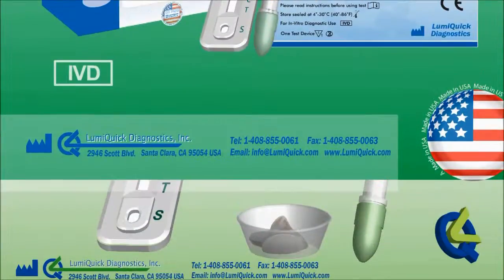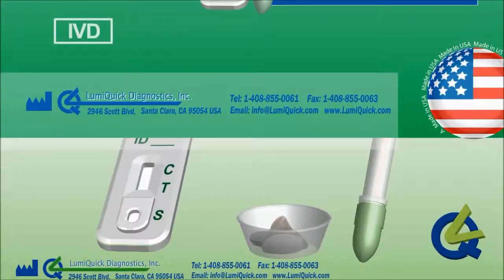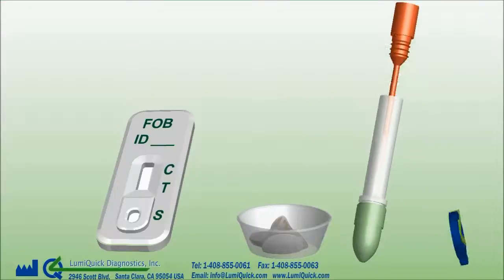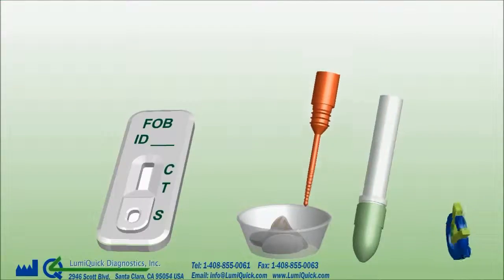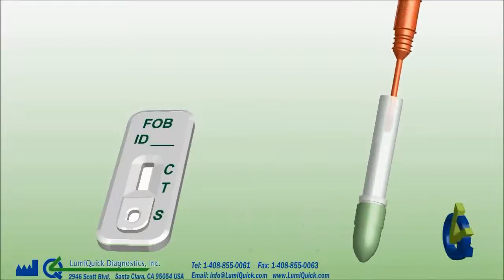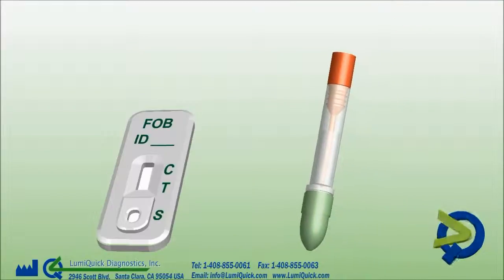To use the test, remove the device from the sealed foil pouch. Screw up the red cap. Pick up a stool sample with the sample pick. Replace the sample pick back to the tube and screw tight the red cap securely. Shake the tubes vigorously for about 5 seconds.